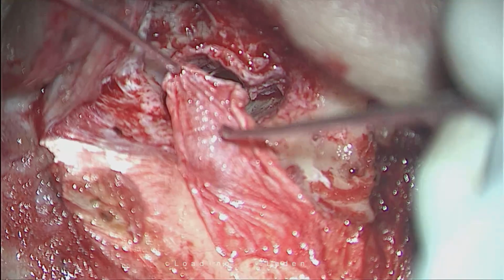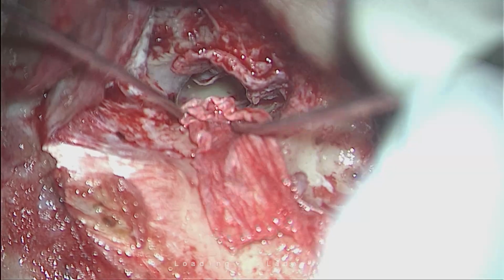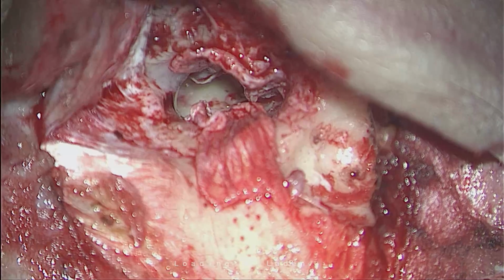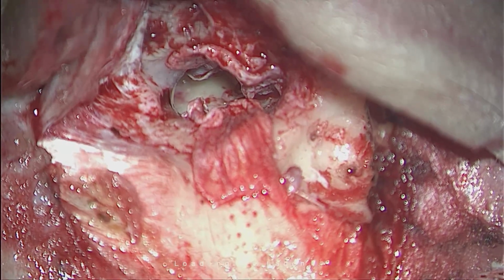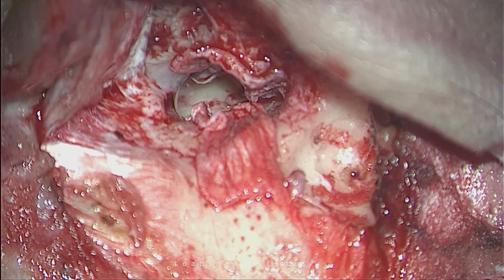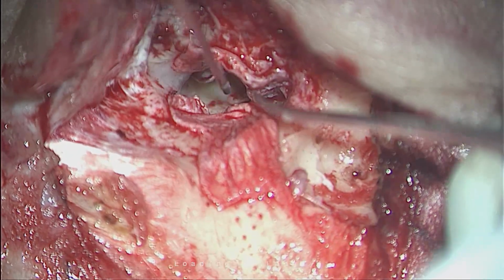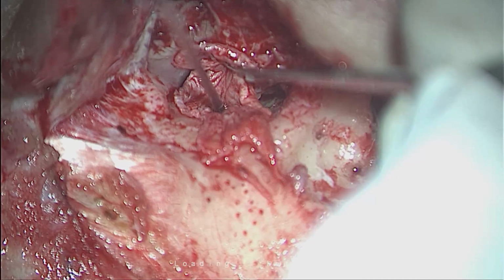A lot of people tell me that this would be more difficult to handle than a dry graft. Side of the graft is important, sir. Which side do you have to face? Yeah, I do it upside down. The raw area facing the under surface more and more. Both sides are raw, but see this?